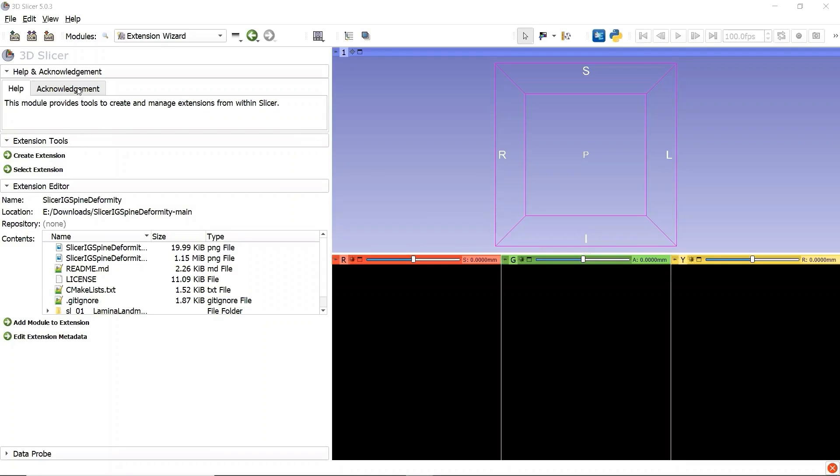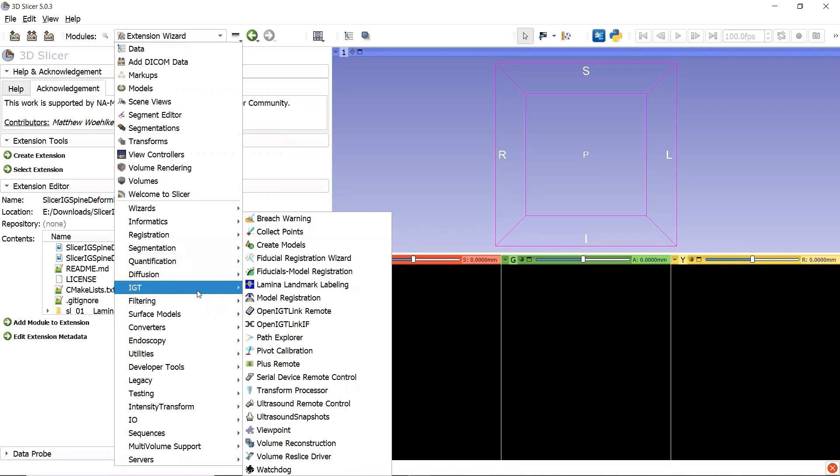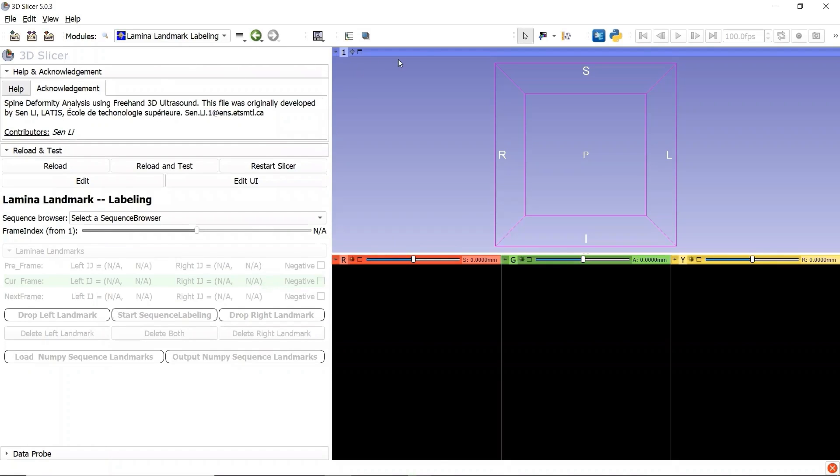Now, if we go to the module selection and find the category IGT, we can find the module Lamina Landmark Labeling, whose icon has a blue background color. We can add this module to the favorite modules for fast access.